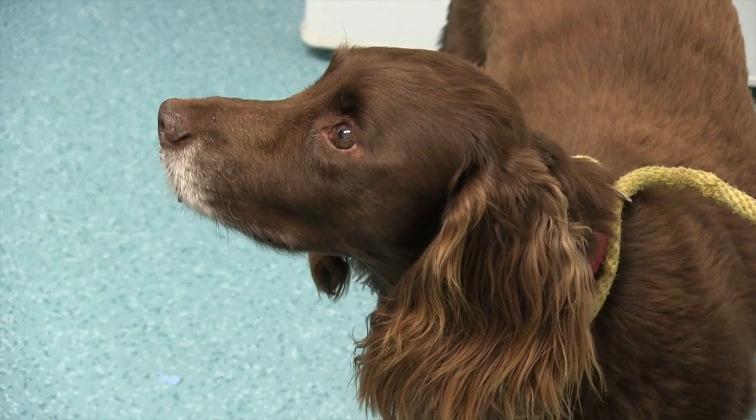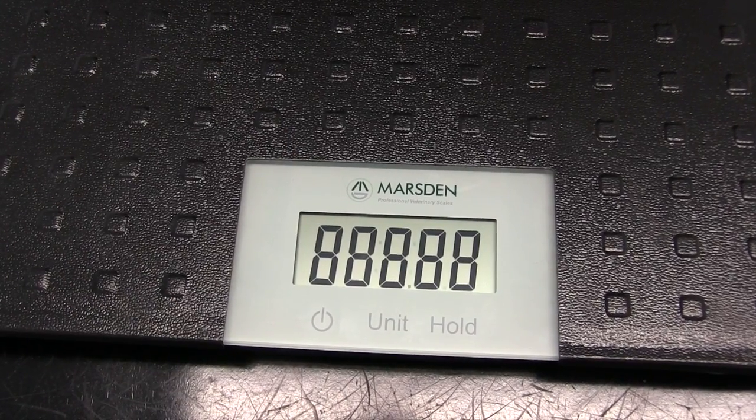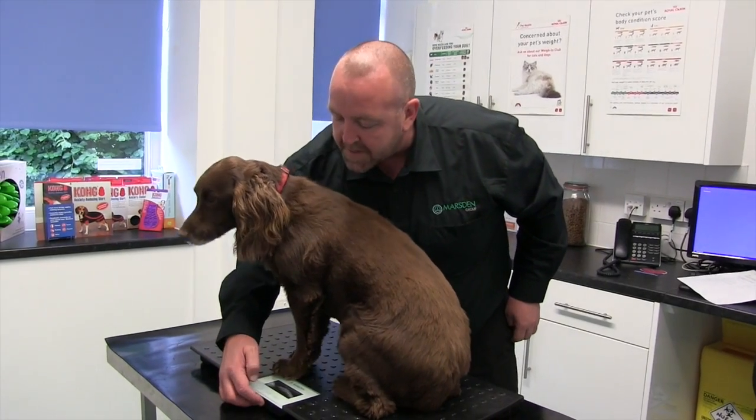Murphy here is going to help demonstrate the V100. To save any distress caused to your pet, turn the scale on before you weigh them. Once your pet's on the scale, press the hold button.